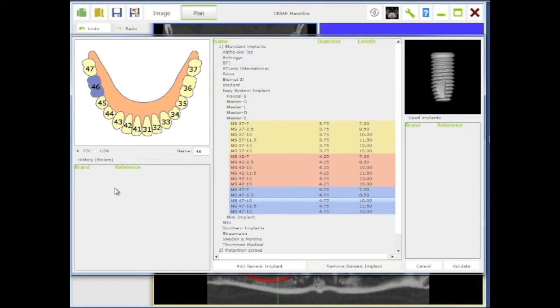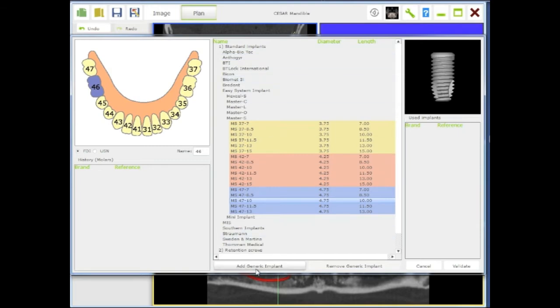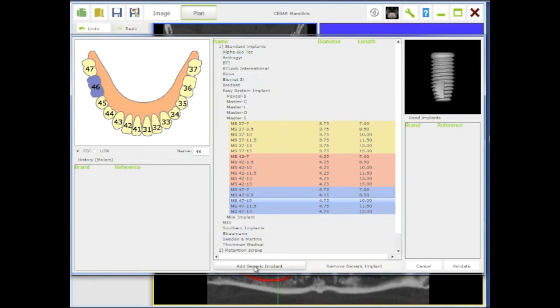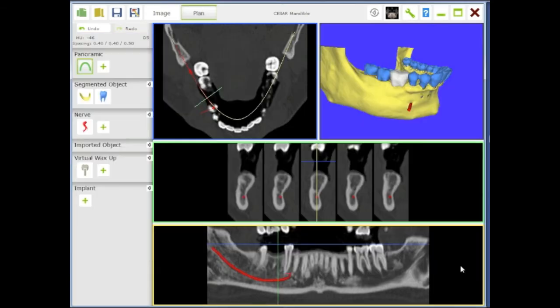You will be able to select it directly from here. If you do not have your brand which is selected here, you can add a generic implant, and doing that you will be able to add whatever kind of implant in diameter and length you are using.